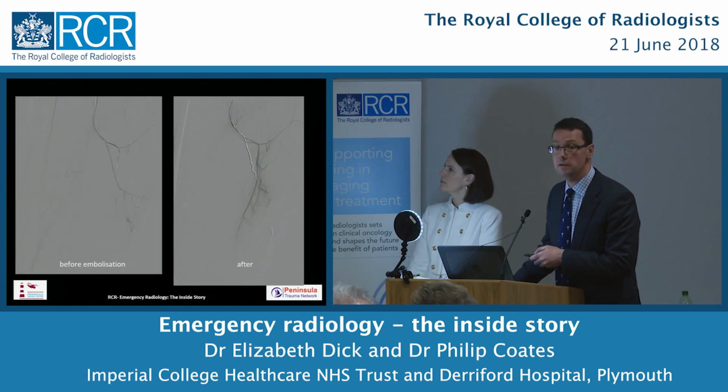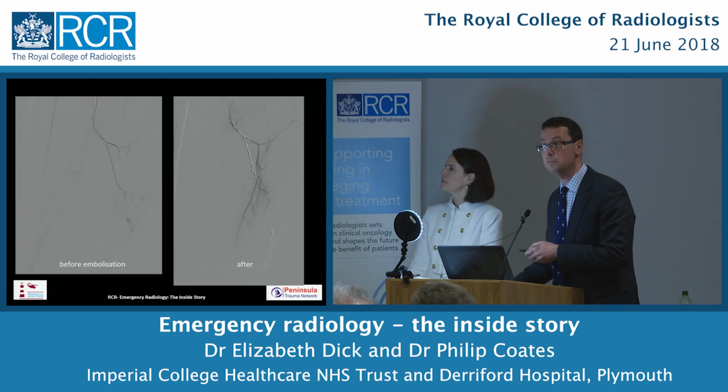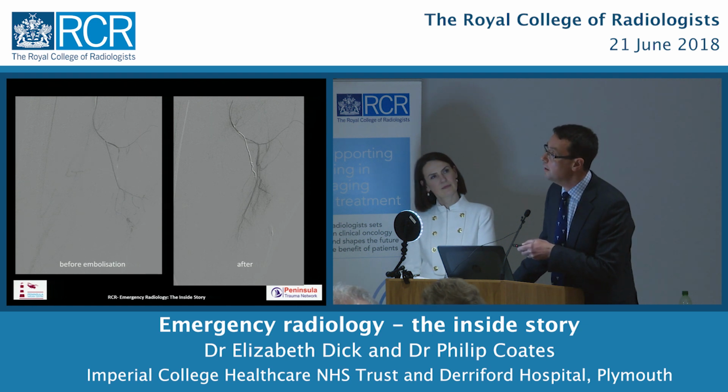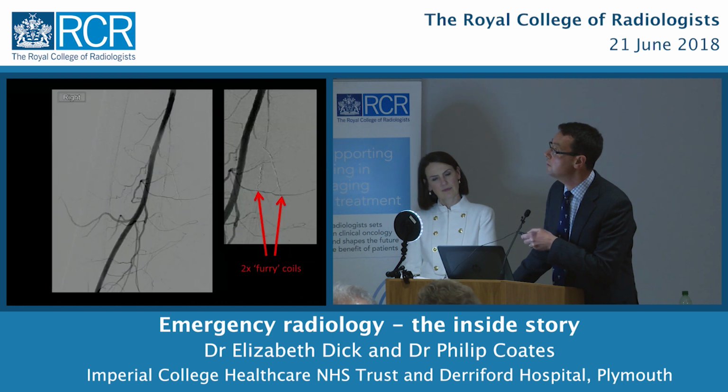So we're going to try and put some embolic coils into this. These are platinum coils, which ideally will stack up and block the blood vessel and achieve clot formation. So before embolization, we've got our blob there of bleeding from these blood vessels which are feeding that, and then post-operatively we're not seeing that anymore. And again, the final result, we put another coil in a side branch next to it, which we thought was also contributing to the bleeding here.